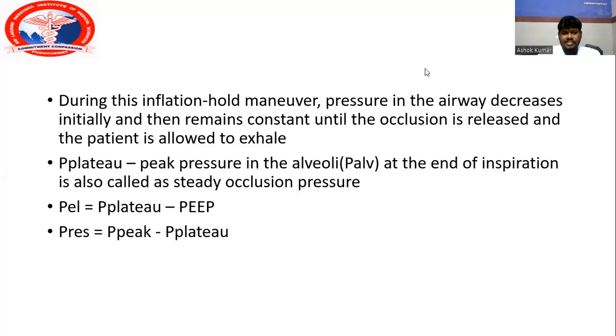There are two formulas: first for resistance pressure and second for elastic pressure. Resistance pressure is peak pressure minus plateau pressure. Elastic pressure is plateau pressure minus positive end expiratory pressure.